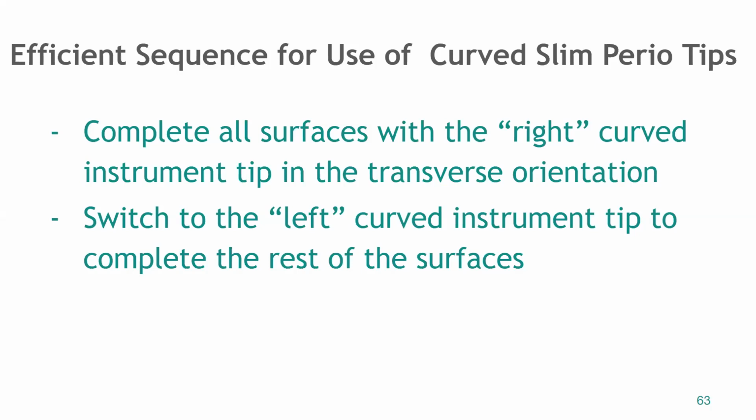Some of you guys will love the curved tips, and that's awesome, but it's just for efficiency. Like if you were just doing a prophy and you wanted to use the curved tips, you'd want to do all the surfaces that you would use with the right curved and then all the surfaces you'd use with the left curved, okay?